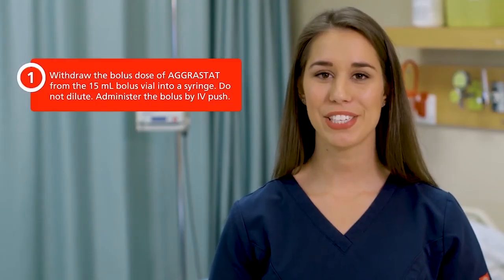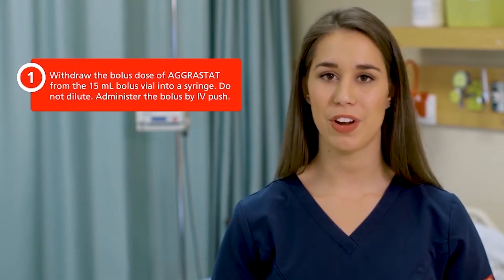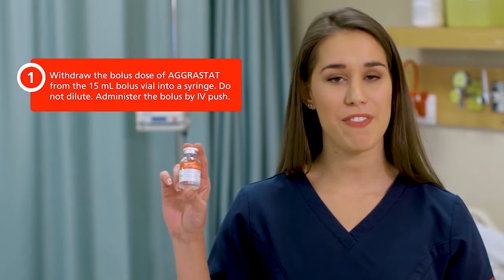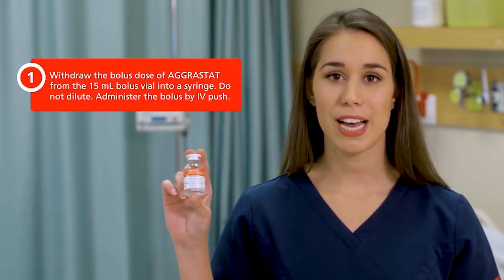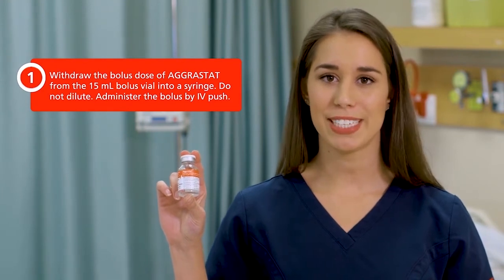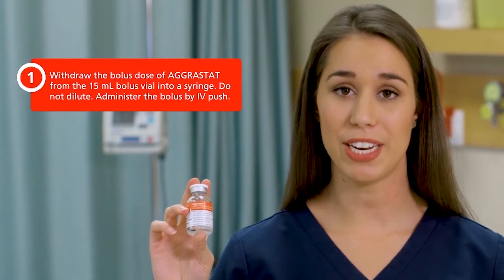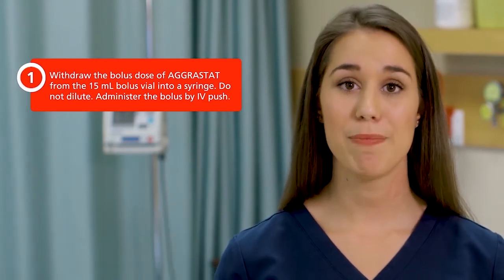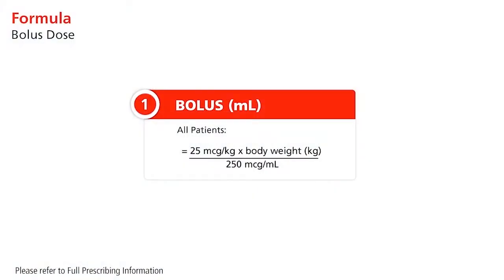Step 1. Administer the bolus dose. To open, remove the vial from the light protective carton. Discard the product if any leaks are found or if sterility is suspect. Do not use unless the solution is clear and the seal is intact. Withdraw the bolus from the 15 milliliter vial into a syringe. Do not dilute. Administer the bolus by IV push within 5 minutes. The volume of the bolus dose can be calculated using the following formula.